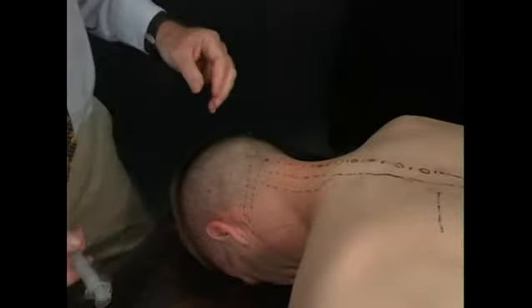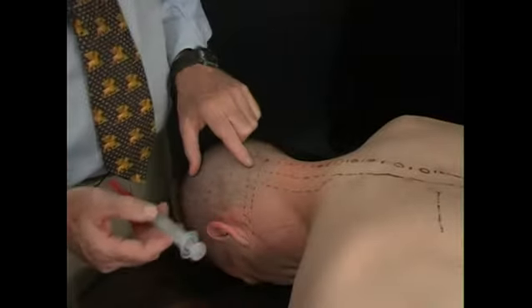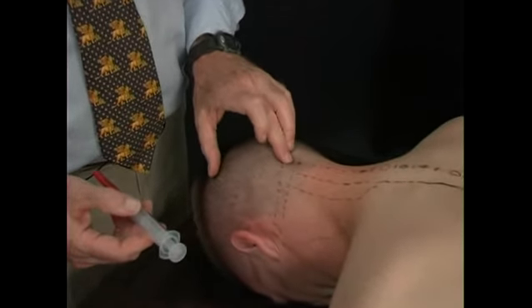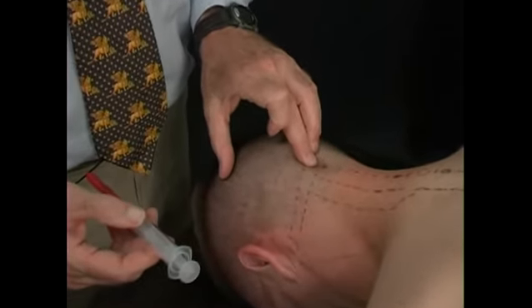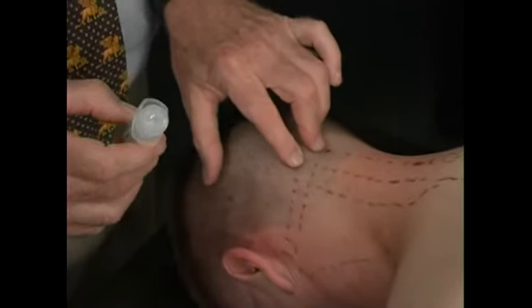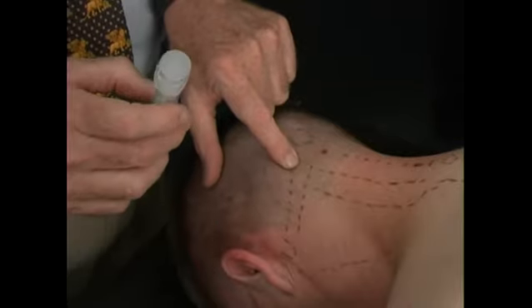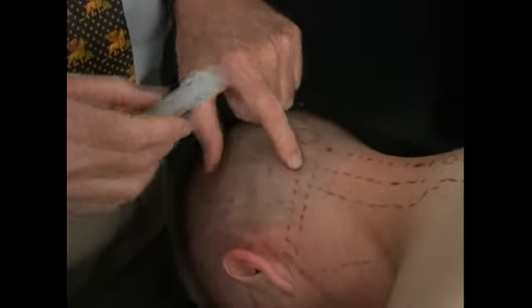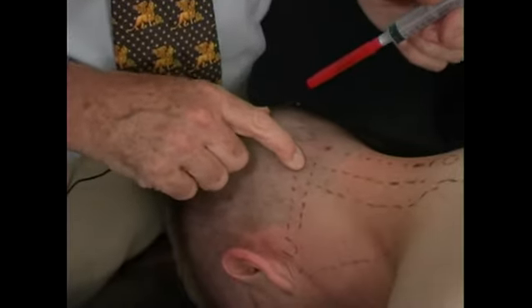We take our syringe with our chosen solution. Again, we keep our finger below the inion, in the no man's land in the middle, and we find that nuchal ridge again, keeping our finger on the skin, palpating the anatomy. I can feel the curve of his nuchal ridge right in that spot.